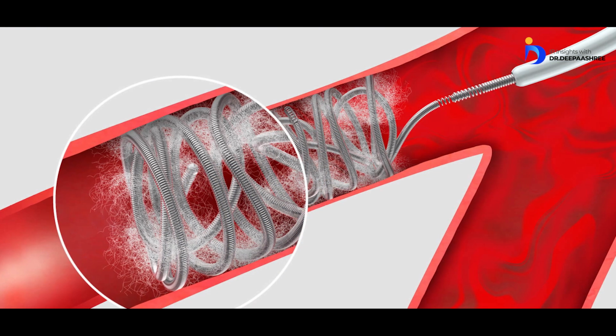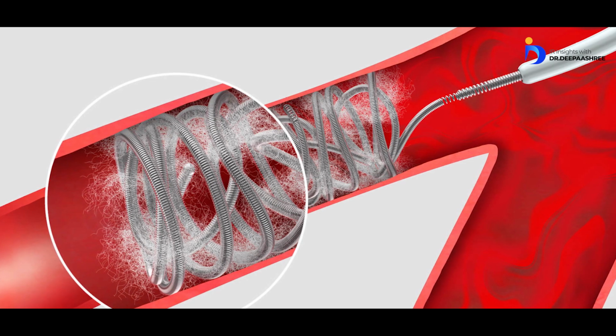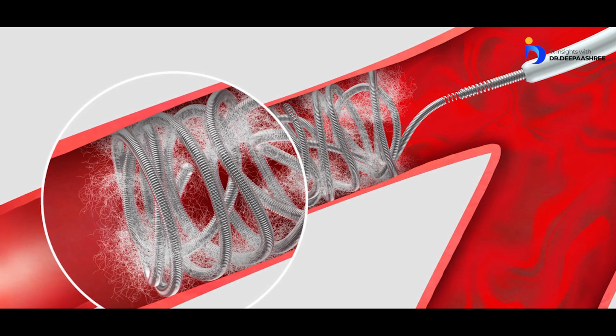Yeah. And there are a few tricks or tips. What I would say is have the mother catheter as distal as possible. Generally, if it is an SMA branch, we keep it at the SMA and then take the microcatheter to the 4th jejunal branch and then start putting coils. We've had problems. So what I do is I take the mother catheter right up to the 4th jejunal branch or as distal as possible, because I need good support.